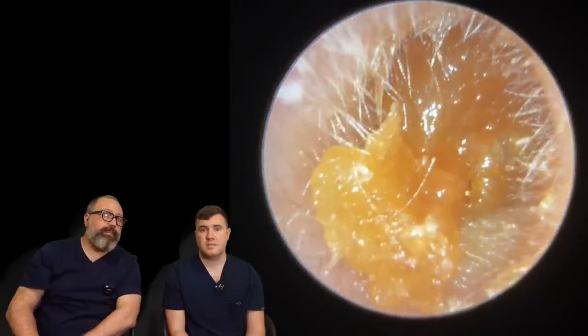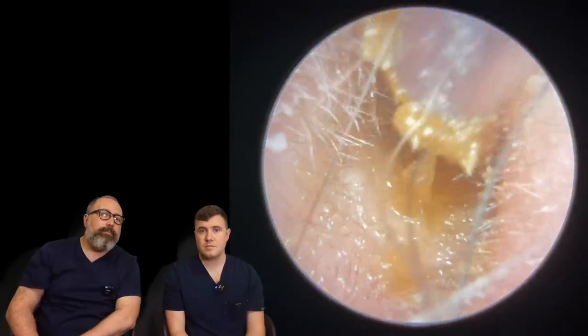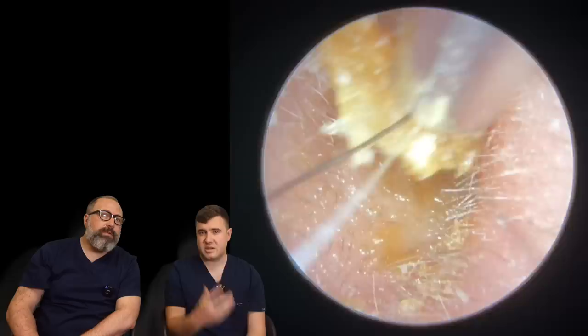Exactly the same on this side, but this one has a bit of wax mixed in with it, so it's a little bit more blocked. That'll be the darker material sitting above the skin.